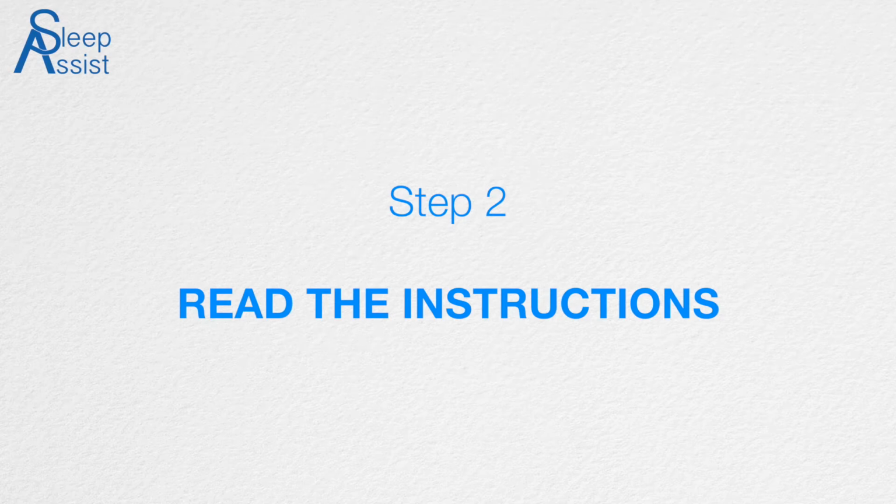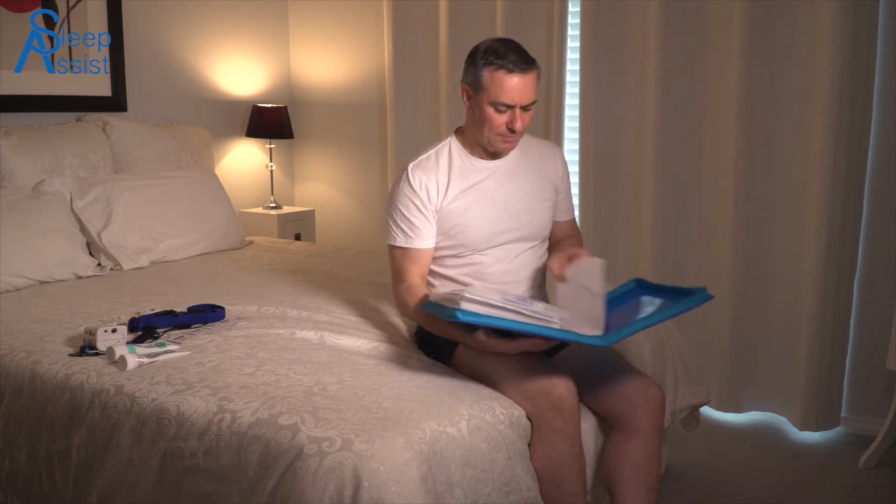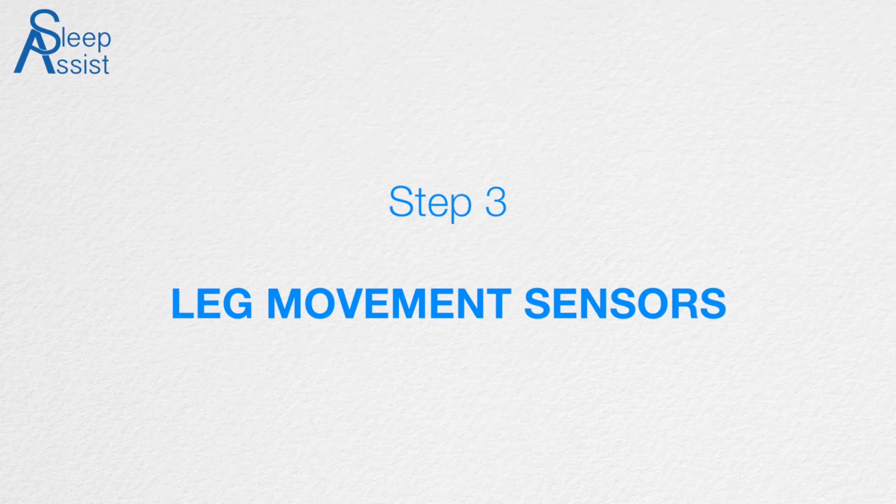Step 2. Read the instructions. Unzip the folder and begin reading through the instructions. This is an important step to understand what you are about to undertake, so please take your time reading the instructions. Step 3. Leg movement sensors.